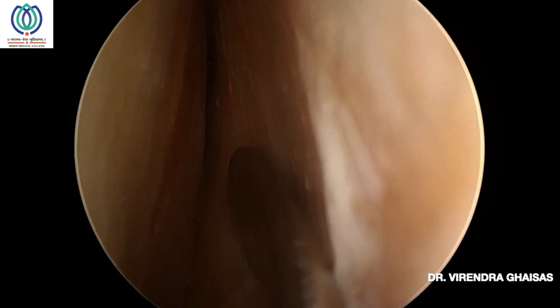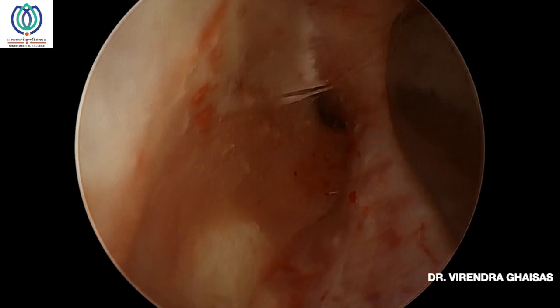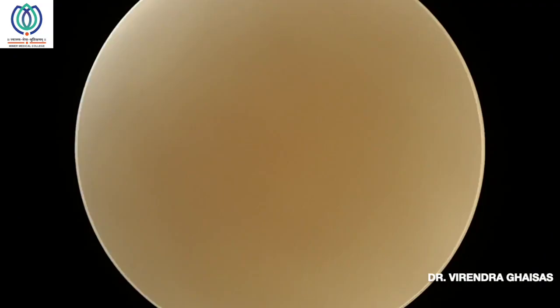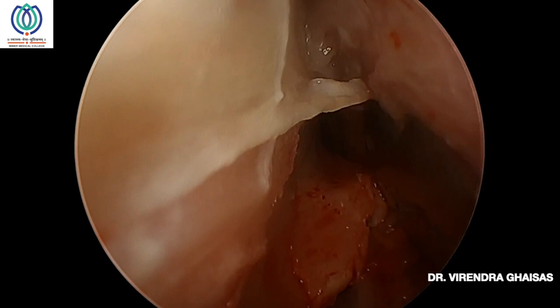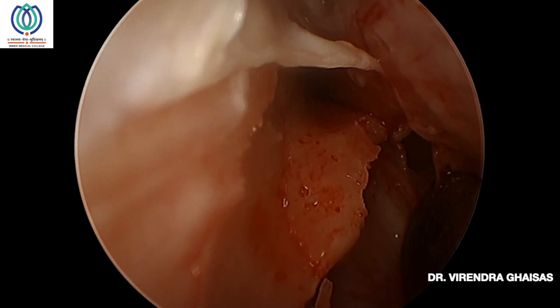After detachment of the upper lateral cartilage from the septum, generally you put an endoscope in a subperichondrial plane to either harvest the septal cartilage or to correct the deviation in deviated noses. So you can see a bony cartilaginous junction. You can see the perpendicular plate of ethmoid, the vomer, and the septal cartilage. During septoplasty, you have to break the bony cartilaginous junction, keeping 1 centimeter of the superior part intact.